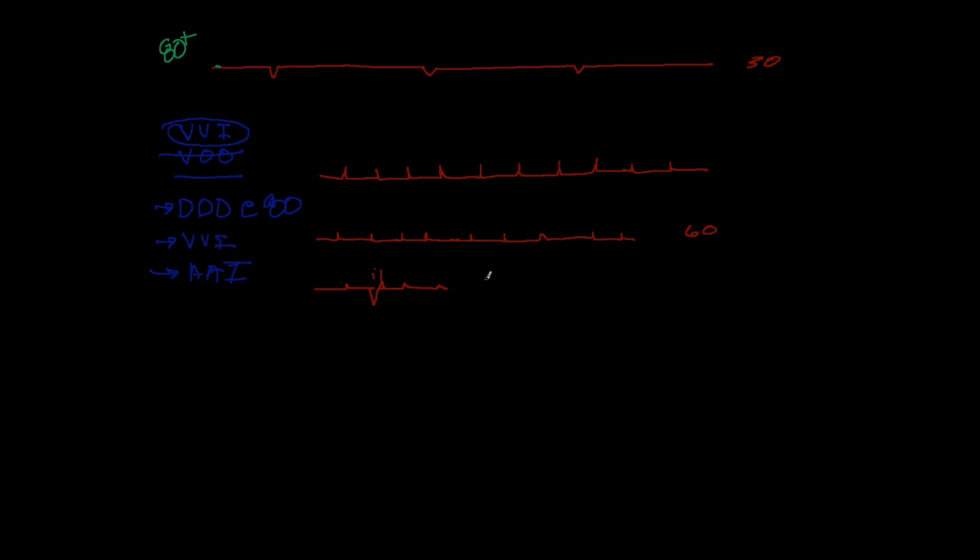And so what you really have to look at in that situation is whether your pacemaker is actually properly sensing. Especially if this is a recurrent problem, where it looks like your pacer is pacing on top of native ventricular beats or slightly after, which is incredibly dangerous, you want to go ahead and take a look at that sensitivity and make sure that it's properly set. You might have to turn up the sensitivity some, and in doing so, if you're pretty much back to normal, then that's your answer.